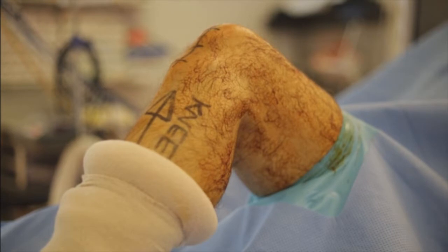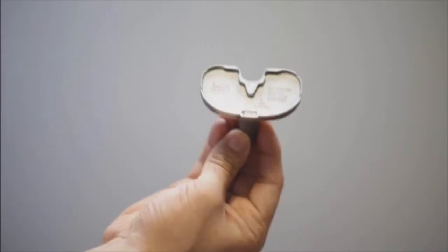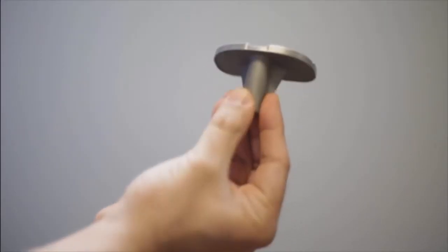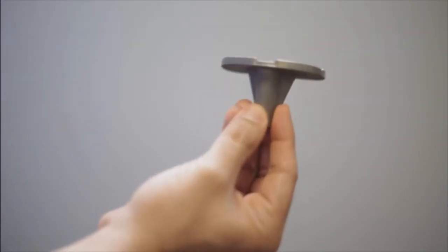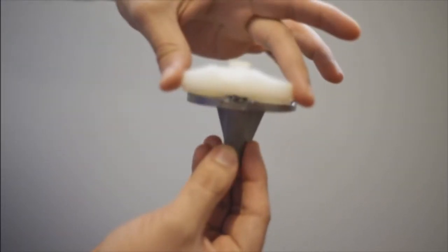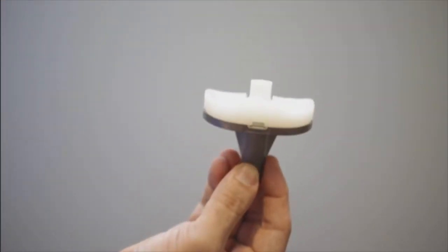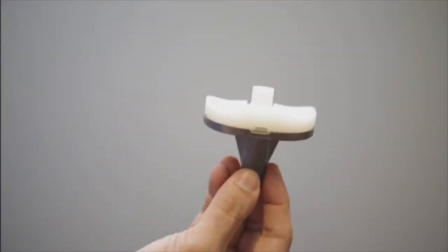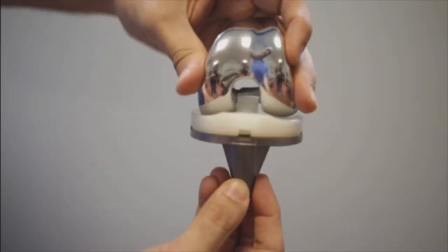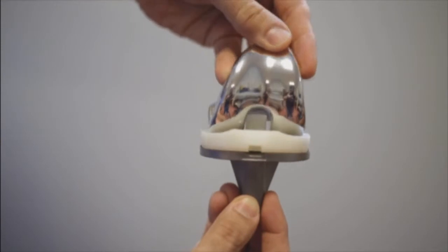Your total knee replacement involves making an incision on the front of your knee, around 15 centimeters long, to expose the bones of the knee joint. The ends of the femur and tibia bones, which have been worn out by arthritis, are removed and replaced by metallic components, which are held strongly in place with medical bone cement. The metallic components are alloys, or combinations of different metals to give them great strength.